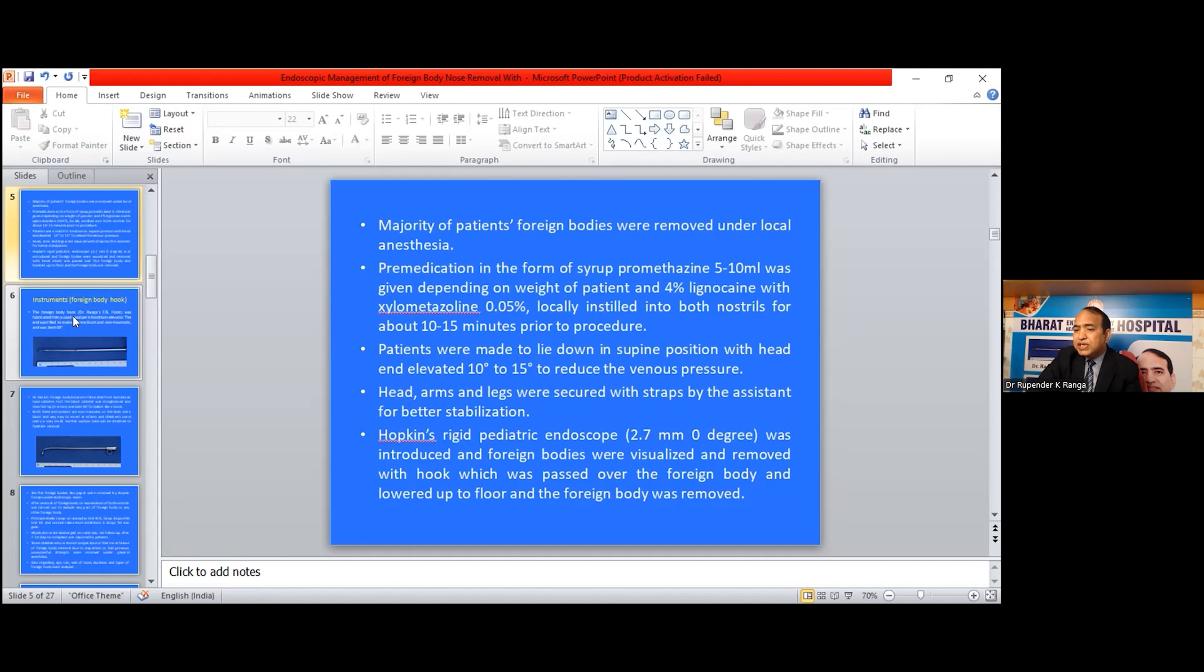Hopkins rigid pediatric endoscope 2.5 mm, 0 degrees, was introduced and foreign body visualized and removed with hook which was passed over the foreign body and lowered up to the floor and the foreign body was removed.